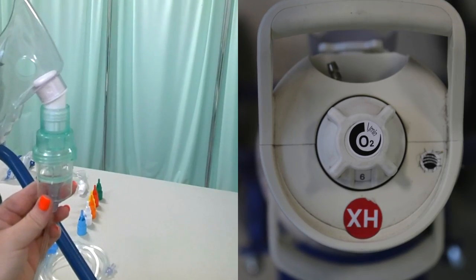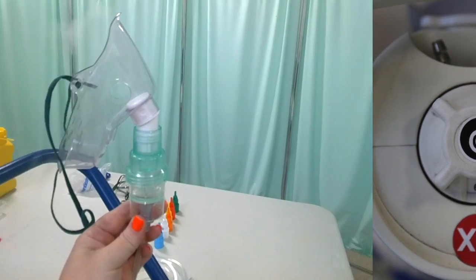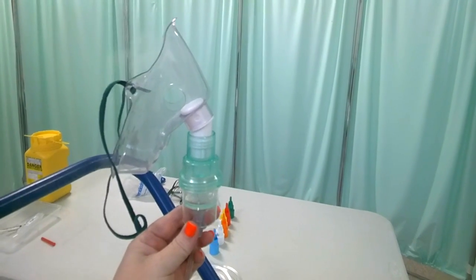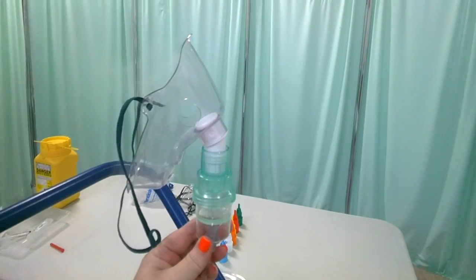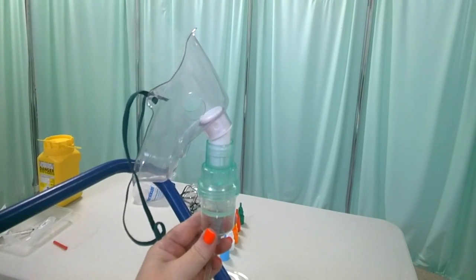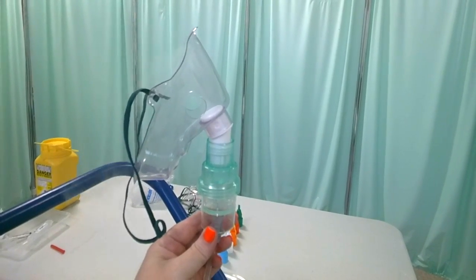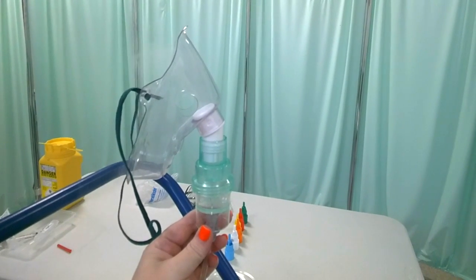So let's go back up to 6 litres again. So get familiar with what that particular sound is like, because that's a really easy way to tell whether you're using your nebulizer mask at the correct flow rate. And that is how we assemble and use a nebulizing mask.